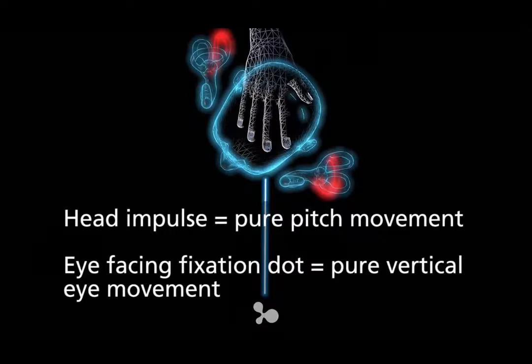When you measure torsional eye movement, you need to do it at a slower frame rate to be able to pick up the torsional component. We are using 250 Hertz to pick up the catch-up saccades, and so therefore at a higher frame rate we cannot measure the torsional component. So we want to make sure that we have just a pure vertical eye movement.